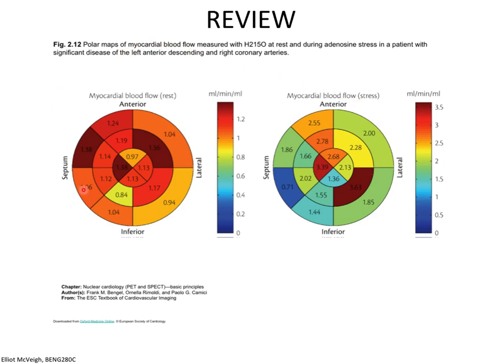And this is a review of what we saw last time. You can actually quantify with nuclear medicine the flow to a specific volume of tissue. And the units of that flow are milliliters of blood per minute per gram of tissue. Right? So if I have a box that's 1 centimeter on a side, that's a gram of tissue, and I ask the question, how many mils of blood pass through that box in 1 minute? And that's myocardial blood flow. That's quantitative myocardial blood flow.